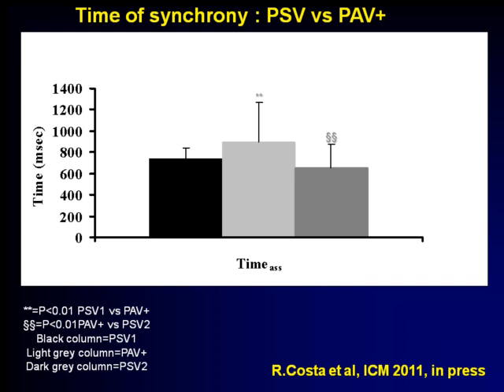And during the study, they were able to show that the time of synchrony, which can be defined as the time in which the respiratory system of the patient, the respiratory muscles of the patient, and the ventilator push perfectly in phase, was significantly increased during PAV Plus if compared with perfectly clinically set pressure support ventilation.